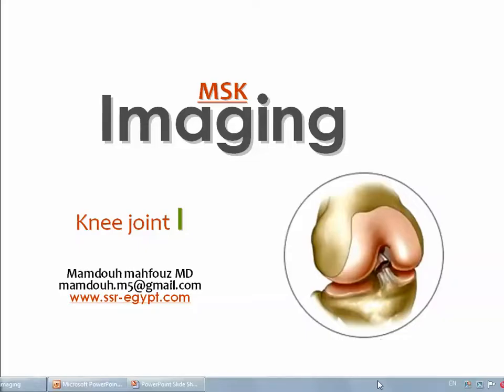Dear colleagues, now we are starting a new series in diagnostic imaging, and it will cover inshallah the musculoskeletal sector. And in this domain we will handle imaging of the major joints, including the shoulder, the wrist, the hip, the knee, the ankle, and maybe the elbow, while I'm preparing now this issue. And also we'll handle the diagnosis of bone tumors using plain X-ray, CT, and MRI.